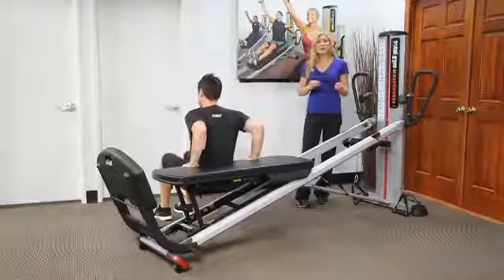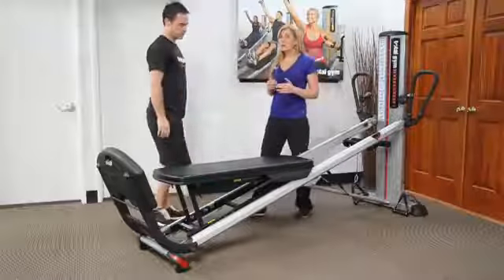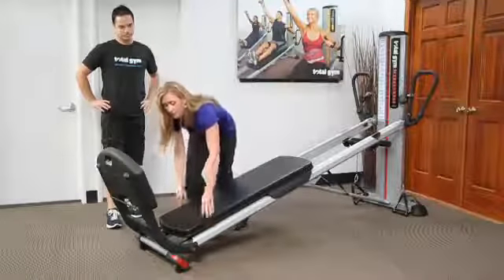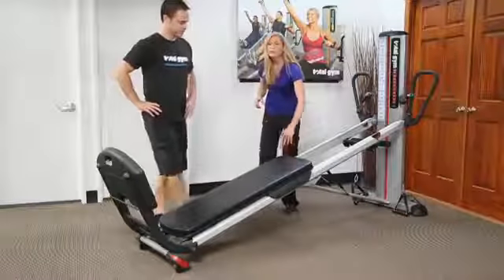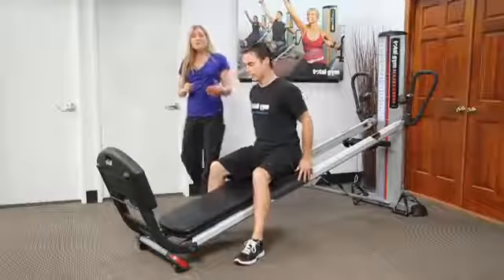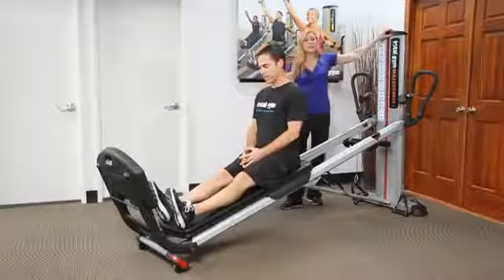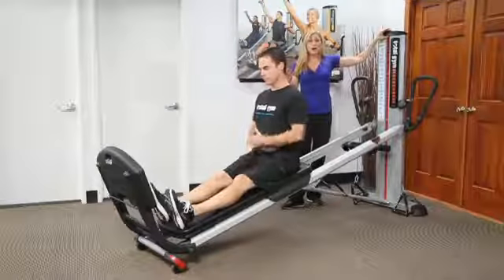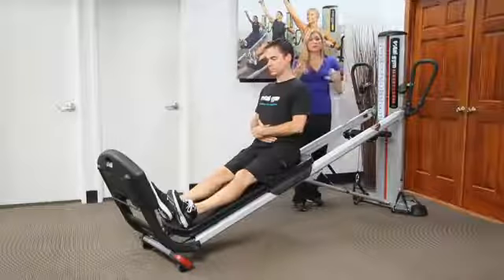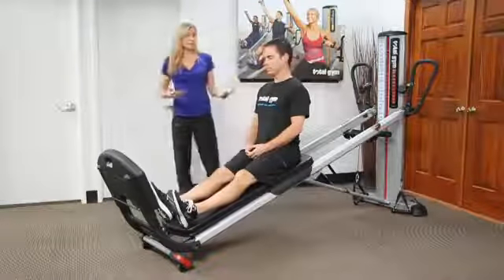Now let's talk about mobility. The higher you go, it's easier and can accommodate when you're facing away from the tower. I'm going to have Jeff sit with his rear toward the top edge of the glide board, facing away from the tower. If his legs are out straight, I can accommodate for hamstrings if I decide to bring the incline level up. The more I bring the incline level down, the harder the exercise becomes with respect to flexibility and range of motion.